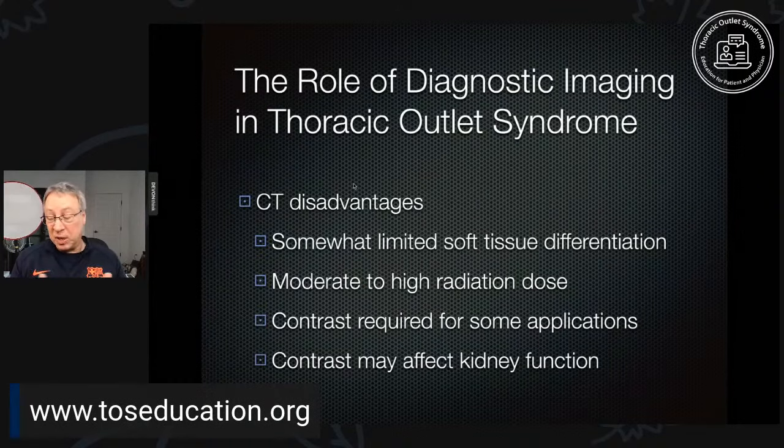And that last line, that the contrast may affect kidney function, is true. So the same thing as with a direct arteriogram or a venogram. When you give contrast, you have to be very mindful of the patient's kidney function.